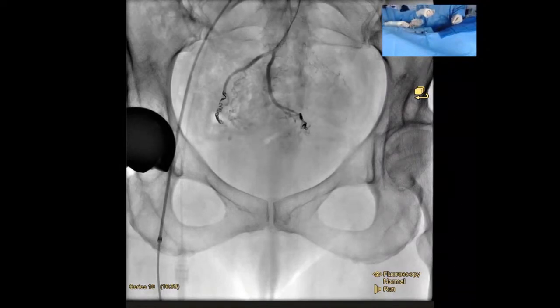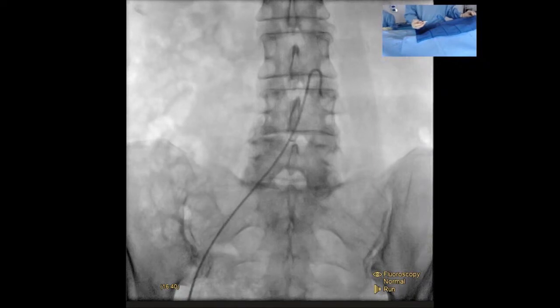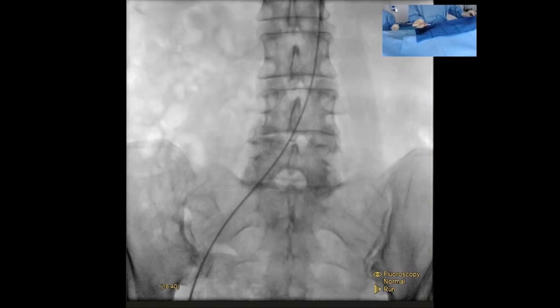Right. I'm taking out that catheter, so say goodbye to it. So we're at the point of the case where you're taking out the catheter. Yep. You're going to close up the artery. This has been, the cases are taking us about 35 minutes or so, 40 minutes. About 35 minutes, yeah, 40, yep. So just to point out how simple these cases can be, once you get used to them.